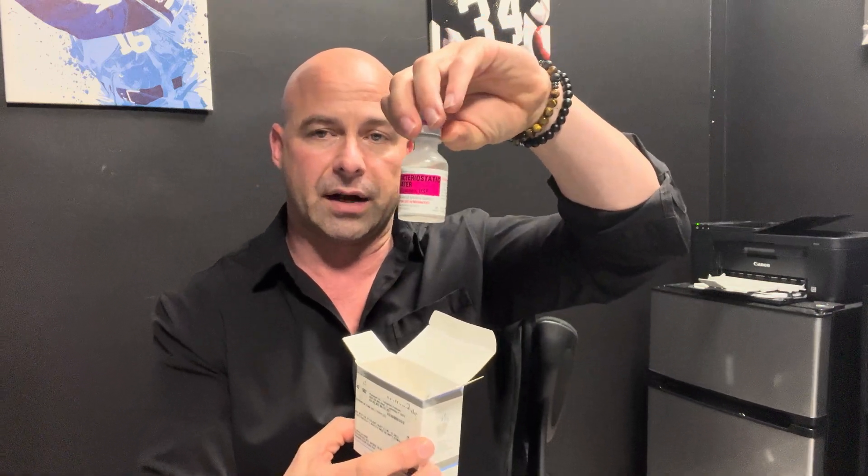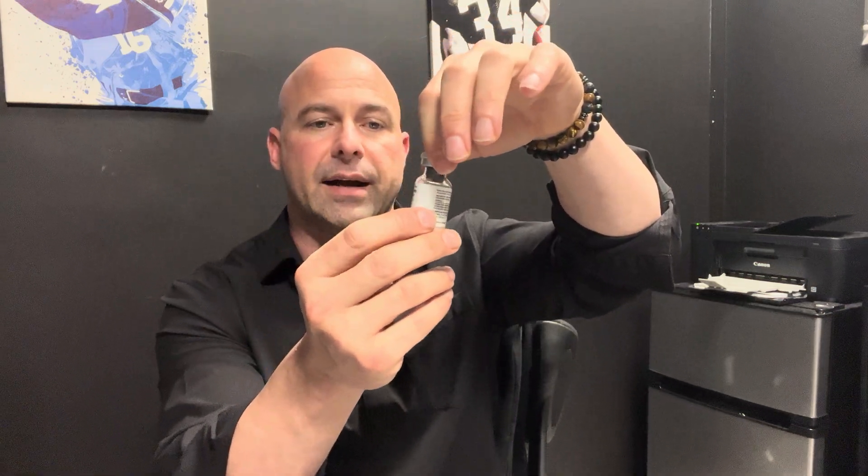Here's an instructional video for how to mix up your Sermorelin peptide. What you should have gotten in the mail from the pharmacy — if you have the version that needs to be reconstituted — is a box like this. Inside the box you're going to have a bottle of bacteriostatic water and also the bottle of the actual peptide. This is the Sermorelin and it's a powder, so we're going to have to mix these together.